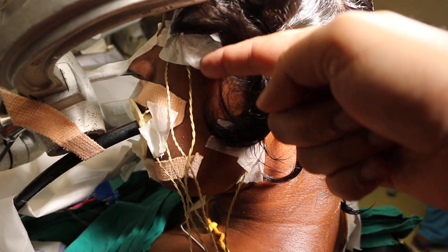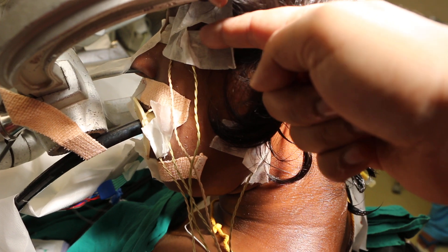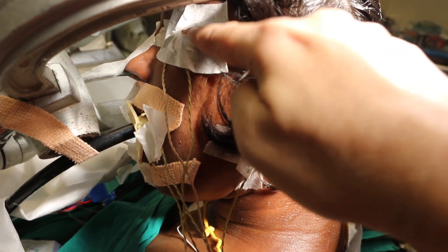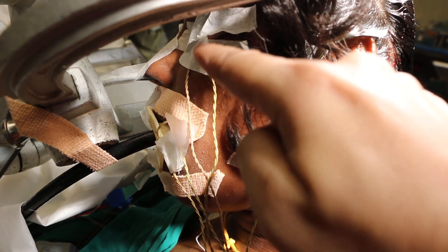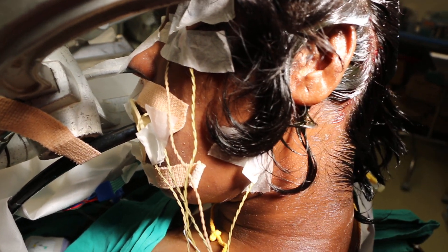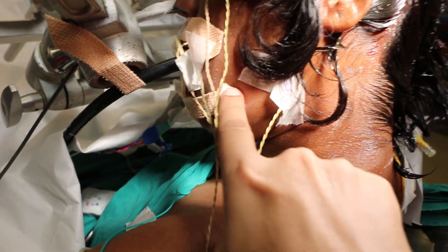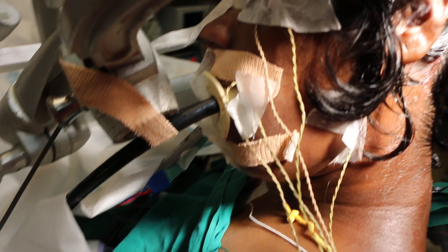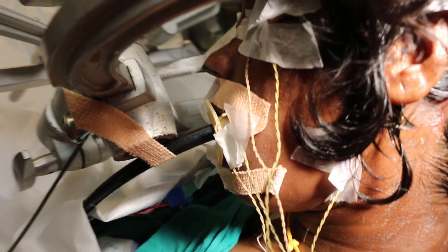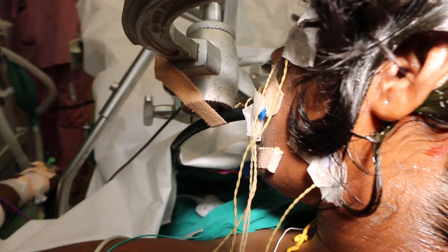Two leads are on the eye: one is for the lateral rectus, which has been slid along the lateral angle of the orbit; two leads are for the orbicularis oris and orbicularis oculi; another one for the masseter; another one for the trapezius. The endotracheal tube has a lead for the vocal cords — that is the tenth cranial nerve.